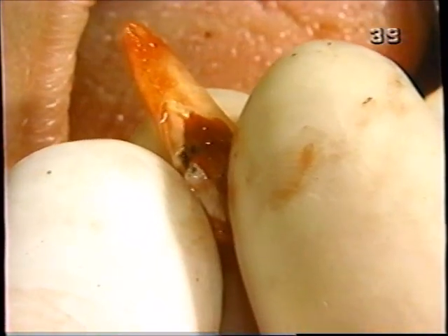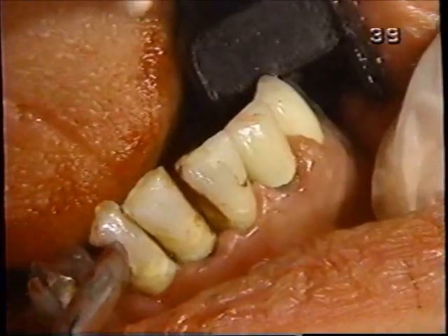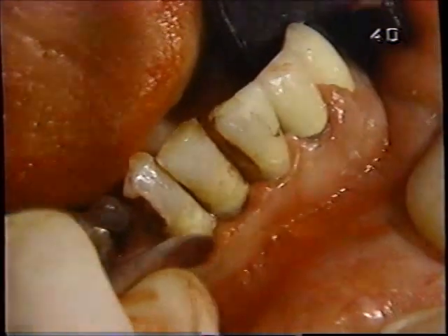So we tried a few different things. You know, things don't always work the first time. Right now we're going to take out these 4 incisors. Now, let's reflect cervically.